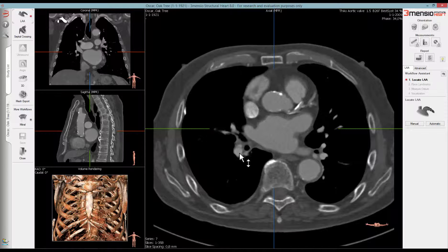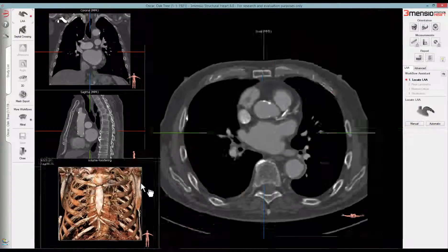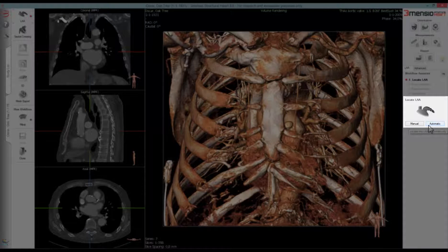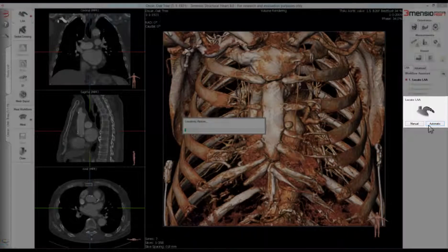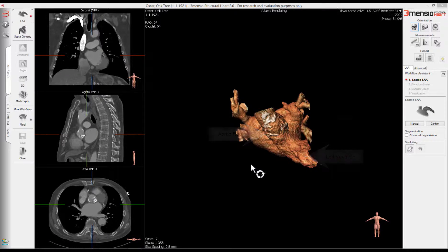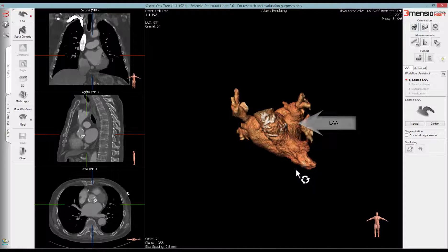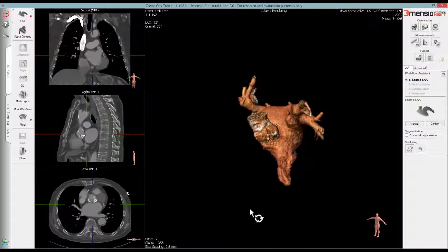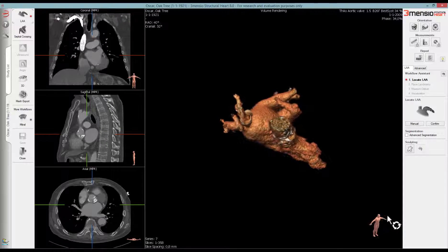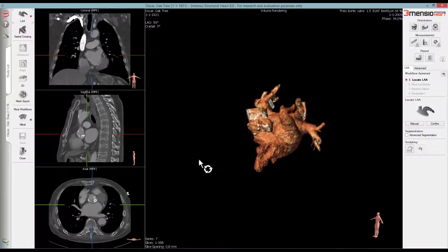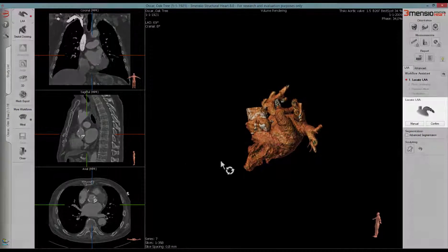Once the LAA has been inspected for thrombus, we want to look at the LAA morphology. Click on the automatic button to obtain an automatic segmentation of the left side of the heart and all the corresponding structures. Rotate the segmentation to assess the LAA from all directions — the shape, position, and relationship to surrounding structures can quickly be assessed. After the LAA morphology has been assessed, press the confirm button.